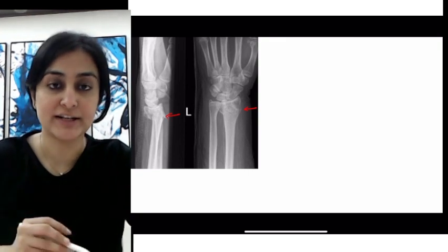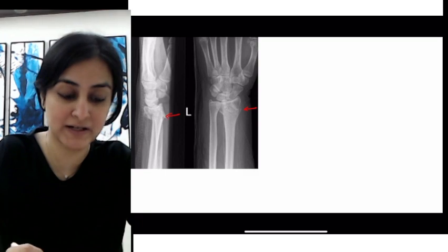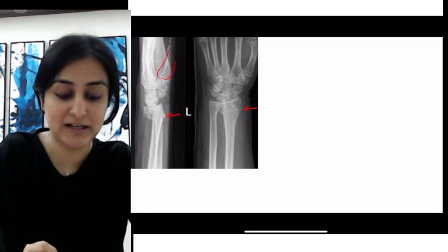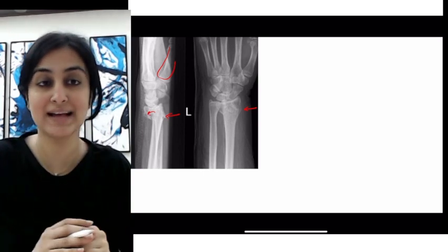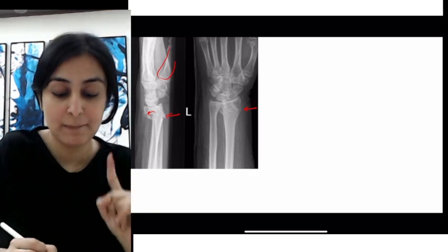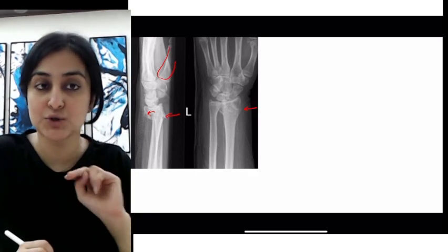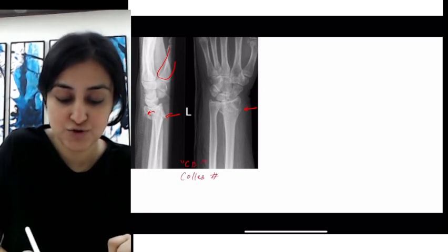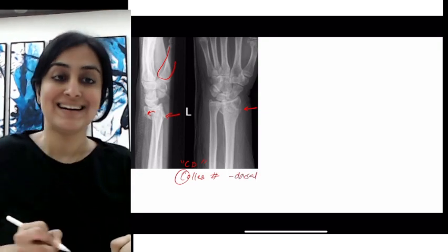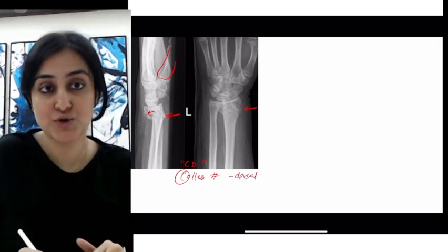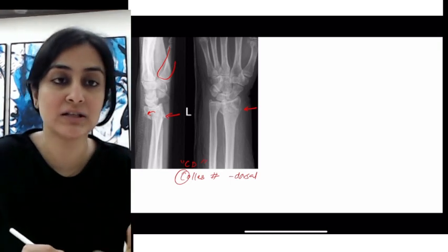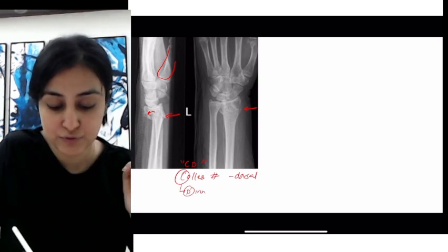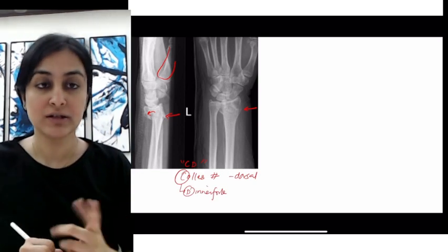First, note that it's extra-articular, then look at the displacement — always look at the thumb. This is the thumb here, so that is anterior. The displacement is against the thumb, so this is dorsal displacement. When you have an extra-articular fracture with dorsal displacement, remember C and D go together — this is Colles' fracture. For Colles' fracture, remember dorsal displacement, and if there is malunion, the deformity you expect is the 'dinner fork deformity.'